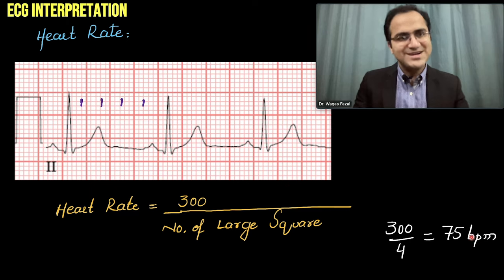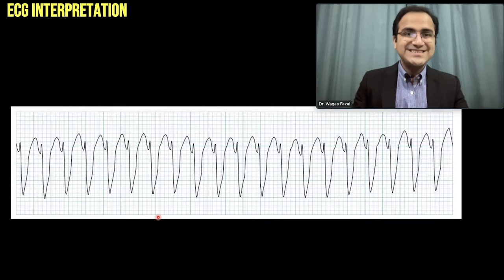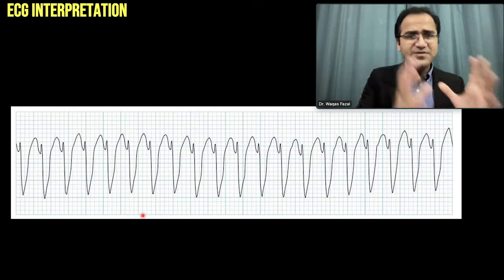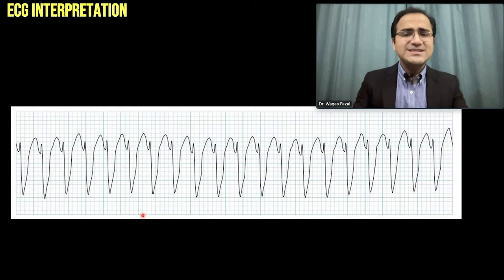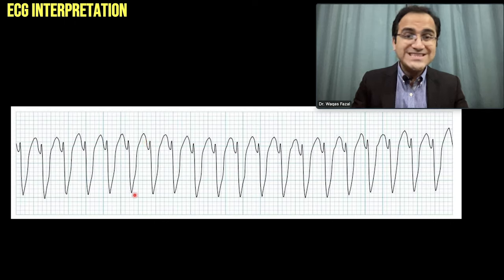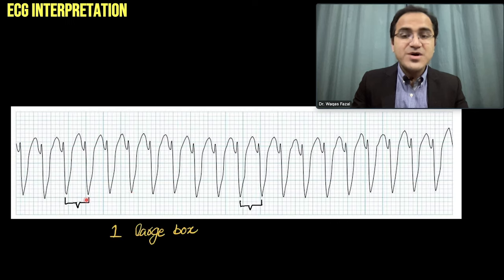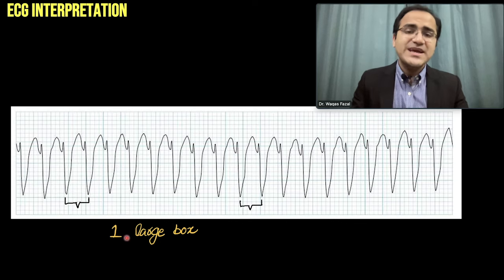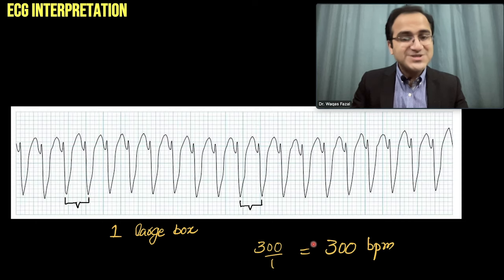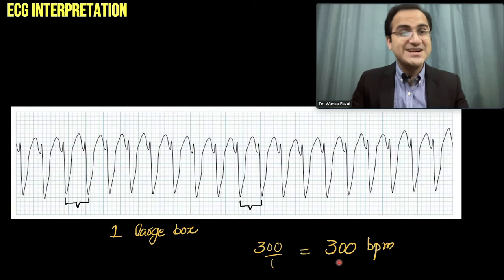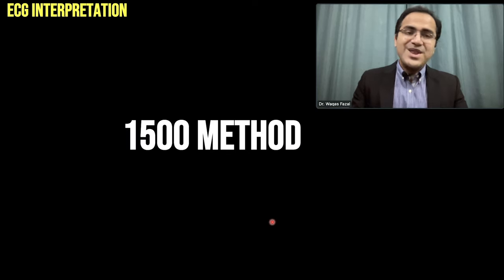Now a more difficult ECG. In such ECGs, look at the point that is clearest — the lower part is typically the QRS complex, and the top is usually the T wave. Taking the lower part, there is almost one large box between these QRS complexes, so 300 divided by 1 gives a rate of 300 beats per minute.